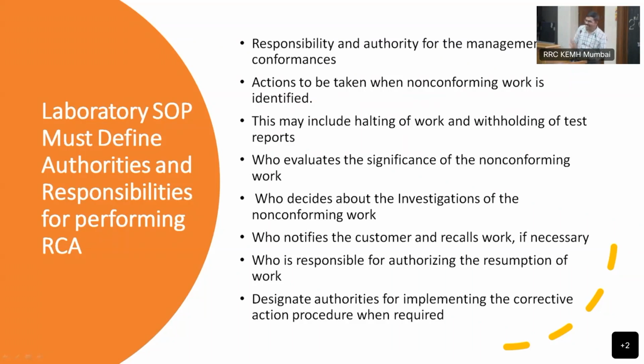Nobody wants to know root cause analysis. That should not be the same. So responsibility and authority for management of it. So telling you actions to be taken when non-conforming work is identified. Is true, correct? This may include halting work or withholding the test reports, correct? Who evaluates the significance of non-conforming work? The technician. Who decides about the investigation of non-conforming work? Okay, these are all things should be documented. Okay, not only documented, I'm telling you, it should be practiced. Okay, that is final level.